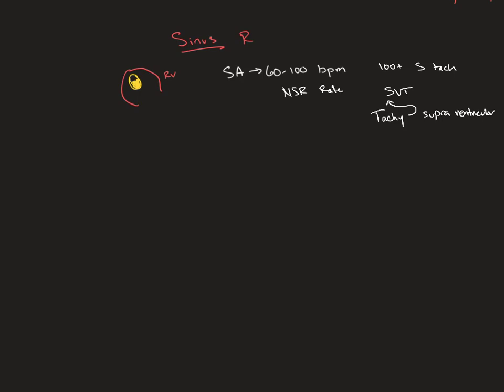So theoretically, and we'll go into junctional after this, if it comes from the SA node, or from the AV node, or anywhere in between, it is an SVT. Whether it's a reentry or a non-reentry tachycardia, technically, sinus tach at 150 is SVT, but it could be a sinus tachycardia. In the same way, so this is our tachy. Any rate less than 60 with a normal appearing P wave showing that it's coming from the SA node is a sinus Brady.